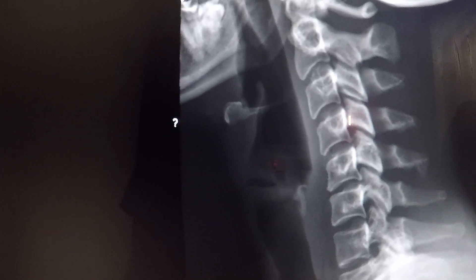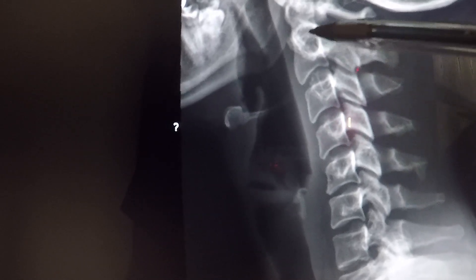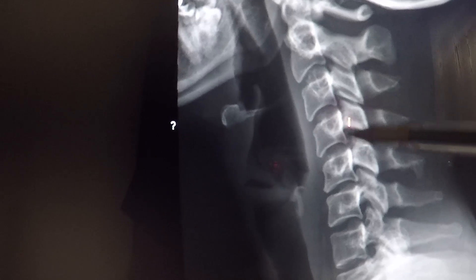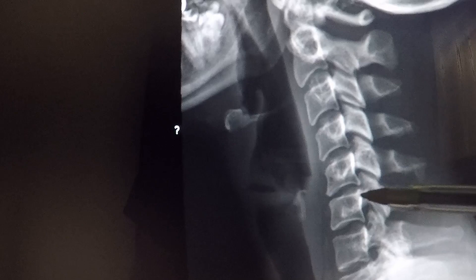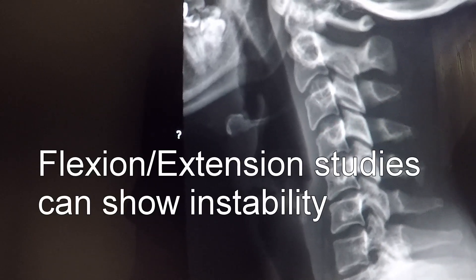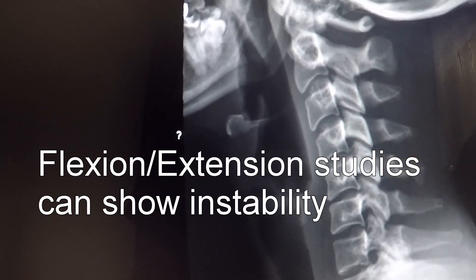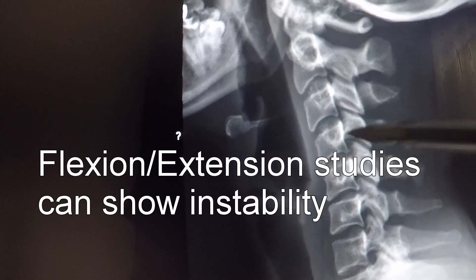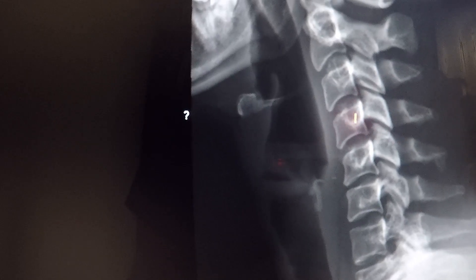Now there is a reverse cervical curve here, and most of the trauma and injury actually occurred between 5 and 6. You can see how the shape of the disc is actually abnormal compared to the others. And then number 4 is slightly forward compared to number 5, and that may indicate ligament instability. We'd have to do another study in order to find out if that's true.